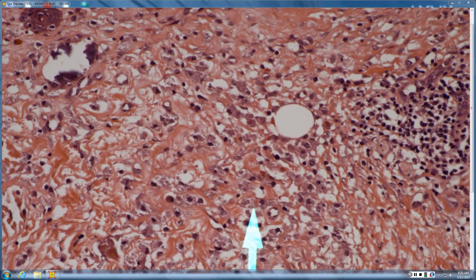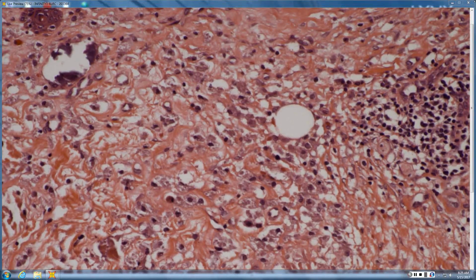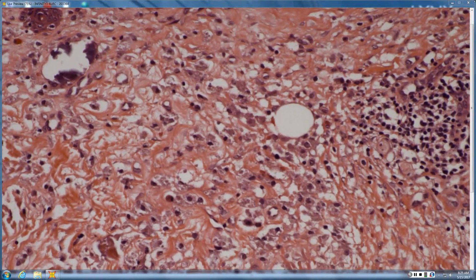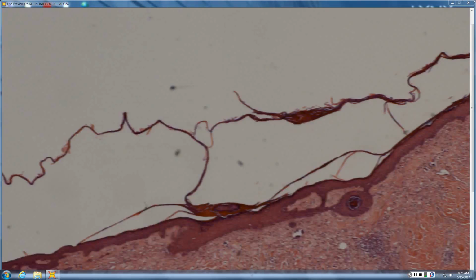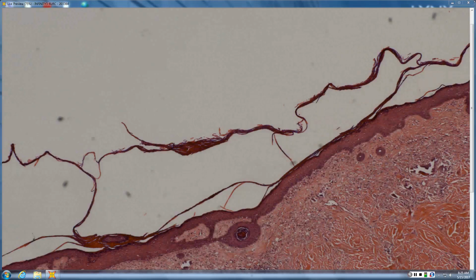Irregular, kind of basophilic chunks, granules within histiocytes, and some necrotic collagen. Put those together, and it looks like cautery change. So that's the change you see in a biopsy site. Tattoo either from Monsel's solution, which would be darker, and the collagen in particular would look brown and necrotic, or in this case, aluminum chloride.